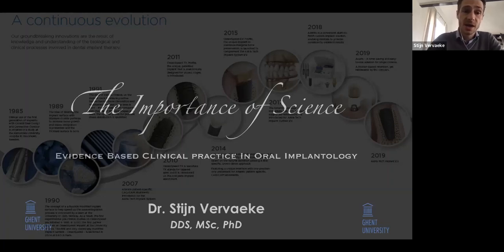So the good old days: I remember Hugo de Bruyn telling me that in the old days, sometimes patients were anesthetized, the flap was raised, and after raising the flap, they saw that there was not enough bone available to install implants. So the flap was closed and the patient was sent home again. Today, this is completely unacceptable with everything that's available to make a proper planning. Also in the old days, the position of the alveolar nerve was determined based on panoramic images. So sleepless nights and a lot of stress were part of an implantologist's life in those days.